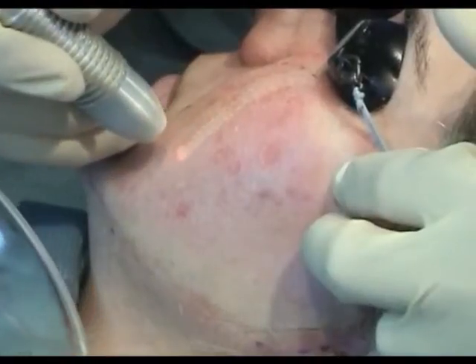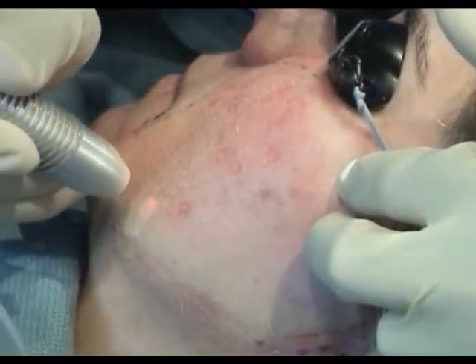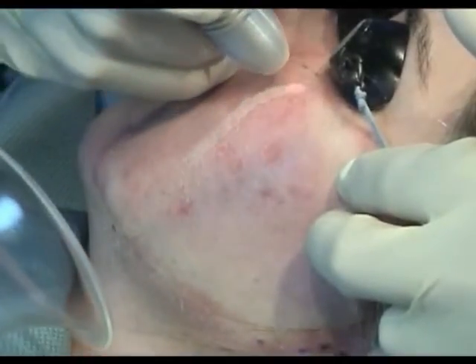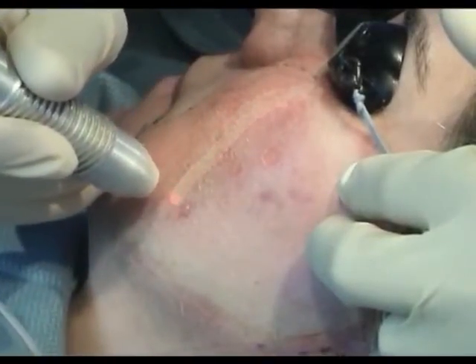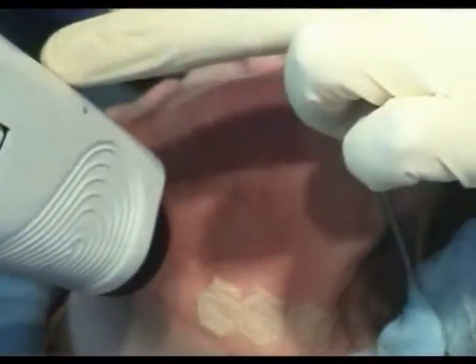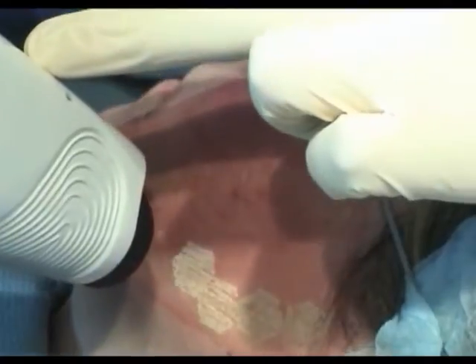As with the prior example, the entire cosmetic unit is then treated with slightly overlapped pulses of the erbium YAG laser. Here again, the 5mm spot size was used with a 10 joule per centimeter square setting. Next, a pass is made with the ultrapulsed carbon dioxide laser. Again, it is critical not to overlap these pulses.